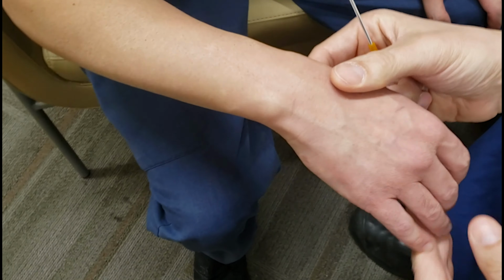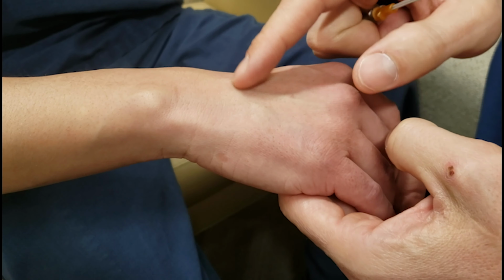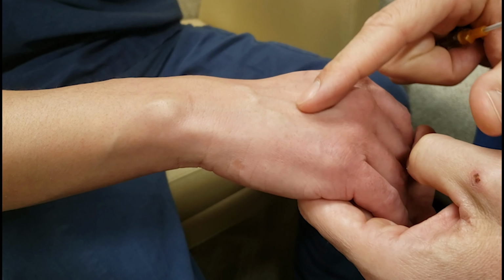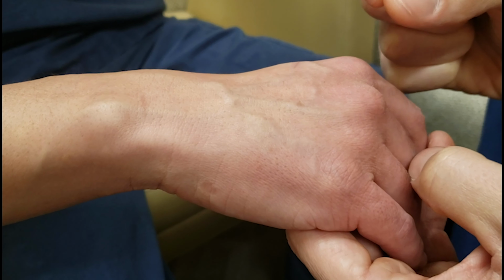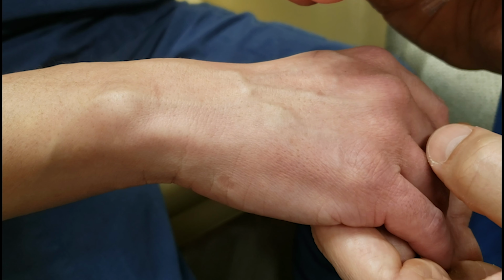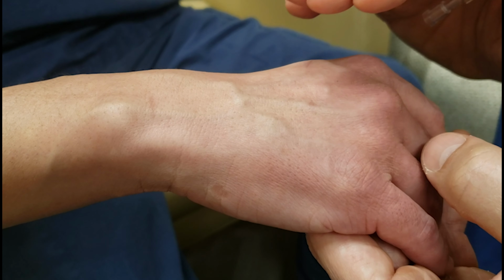Here I'm going to take my 14 gauge just for a demonstration. Here we're going to see really excellent veins. But even someone with excellent veins, they're a bit tortuous. I don't want them to be tortuous because that makes it difficult to get the IV in a straight way. They're also a little lax. I don't want them lax when I put the IV in because I want them in a certain place where I have more confidence to get it in. Also, this particular model doesn't have a lot of soft tissue. In some individuals that have more subcutaneous tissue, the plane of the vein could be in different planes. That could make it difficult.